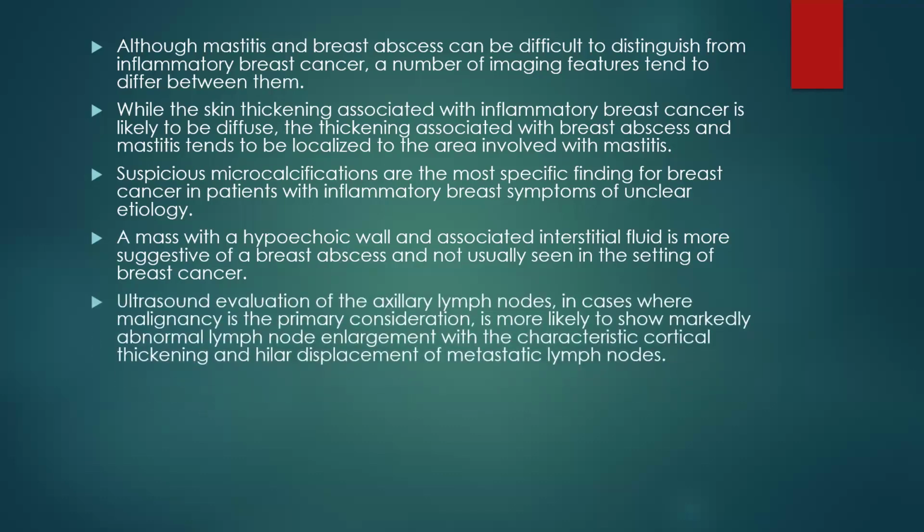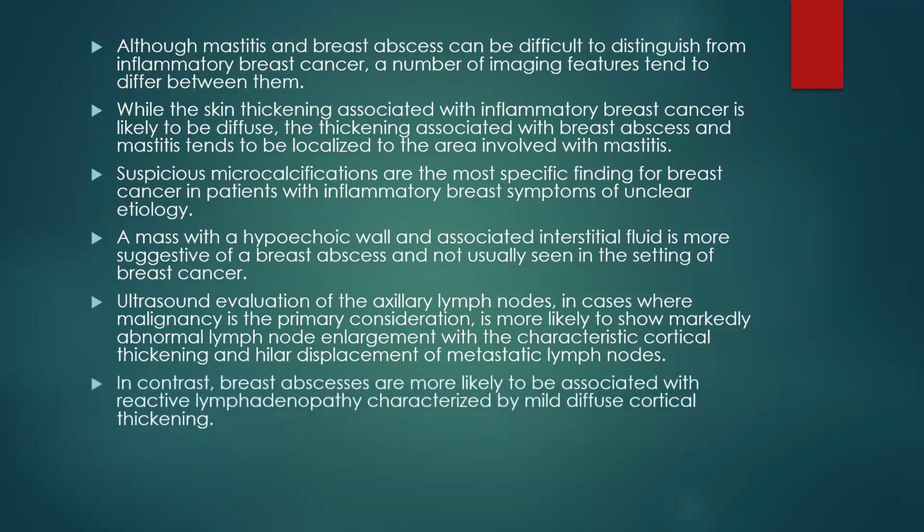Ultrasound evaluation of the axillary lymph nodes in cases where malignancy is the primary consideration is more likely to show markedly abnormal lymph node enlargement with the characteristic cortical thickening and hilar displacement of metastatic lymph nodes. In contrast, breast abscesses are more likely to be associated with reactive lymphadenopathy characterized by mild diffuse cortical thickening.